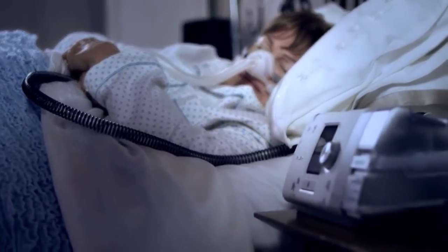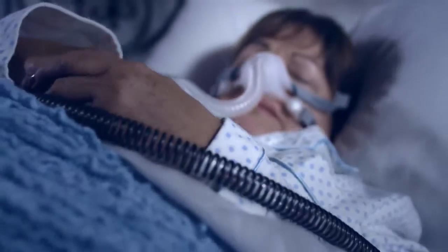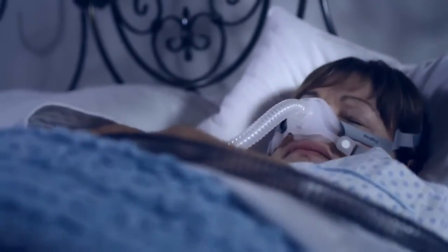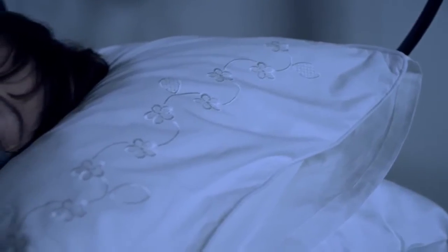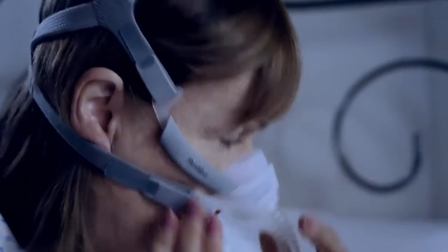It took a while to get used to sleeping with a machine connected to you — wearing the mask, the headgear, the tubing, and sleeping on my side. And realizing there was something there. At first it was hard to get comfortable. It took a while before I worked out how to make the equipment work for me.